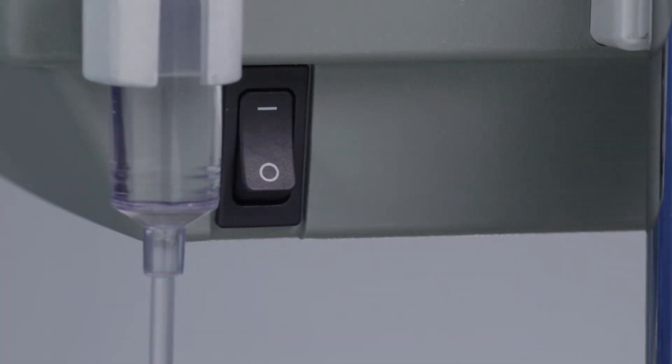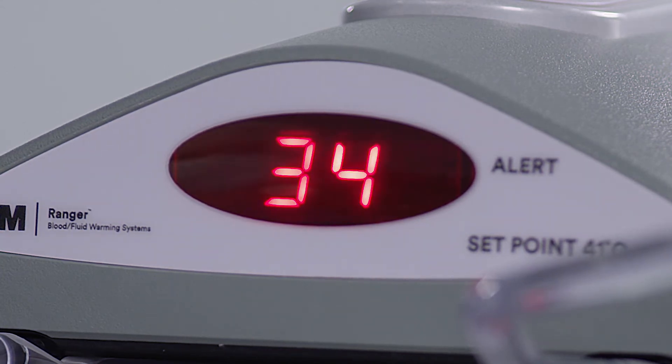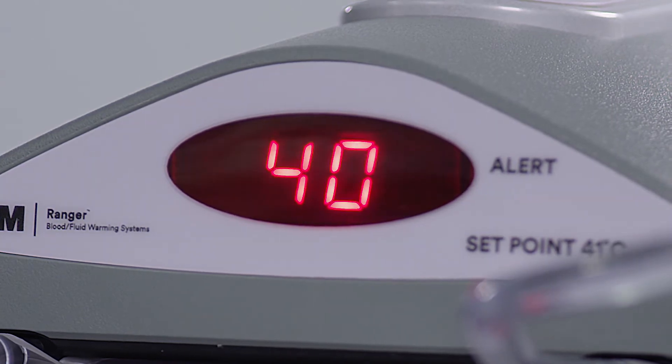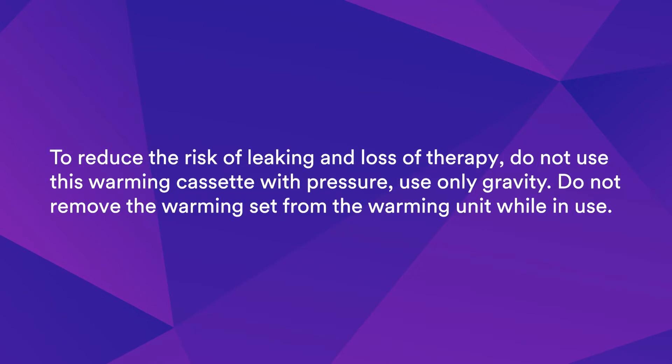Turn the warming unit on. On startup, the unit reaches its normal operating set point of 41 degrees Celsius in less than two minutes. The LED display located on the front of the unit displays the warming unit temperature. The temperature of warmed blood and fluids is verified with sensors that check heating plates four times per second. To reduce the risk of leaking and loss of therapy, do not use this warming cassette with pressure. Use only gravity.